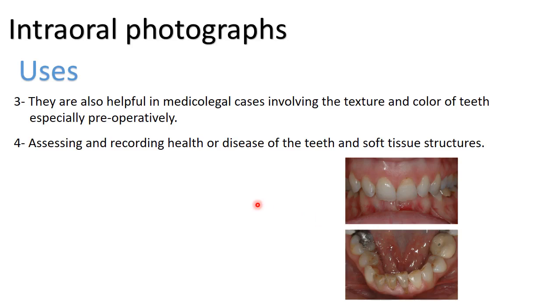And also it's important for assessing and recording the health and the diseases of the teeth and soft tissue structures, like in these cases where there is gum recession, gingivitis and swelling. So it's also a useful tool, and we can explain many things with these photographs.